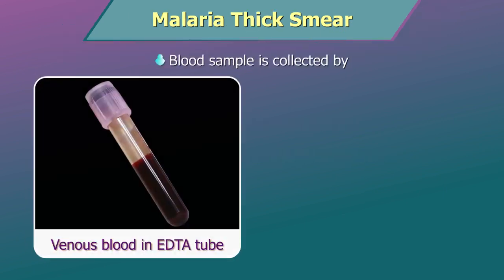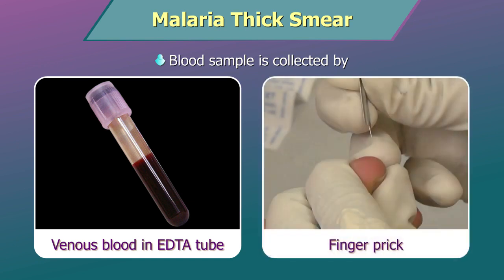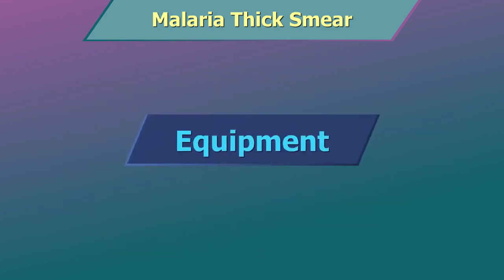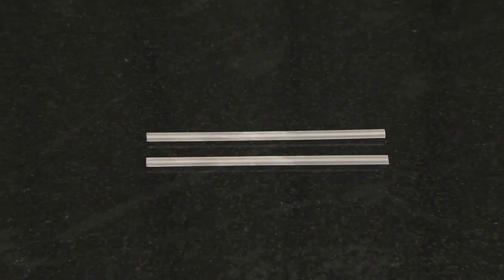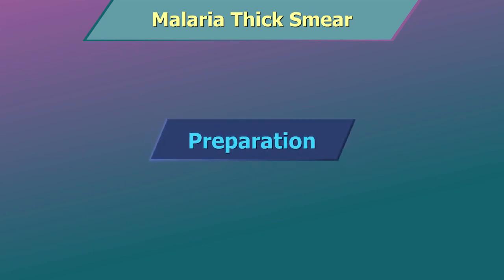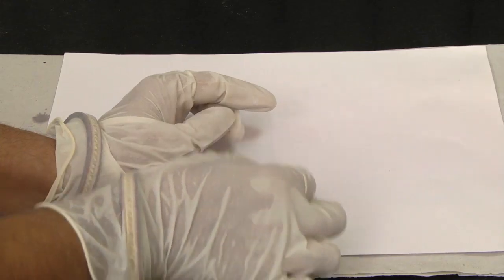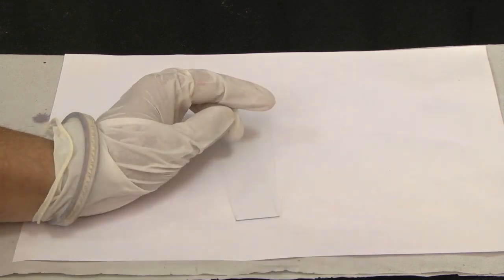Sample: EDTA whole blood venous sample or capillary sample. Equipment: clean, grease-free glass slides, applicator sticks. Preparation of malaria thick smear. Use universal precautions while preparing the smears for malarial parasites.